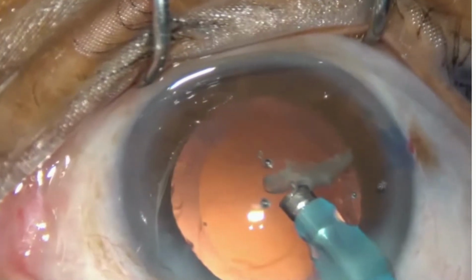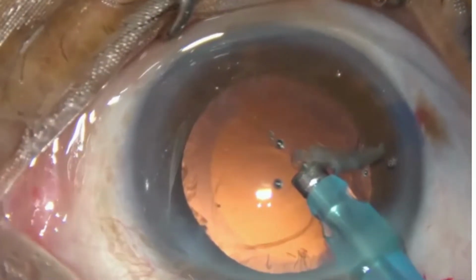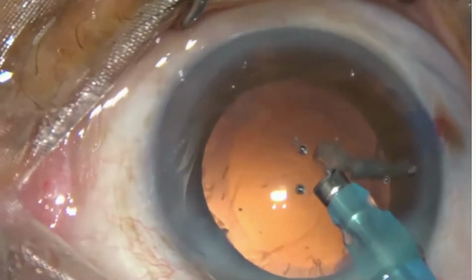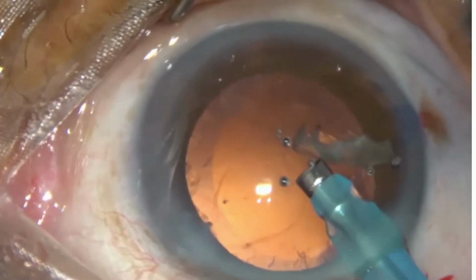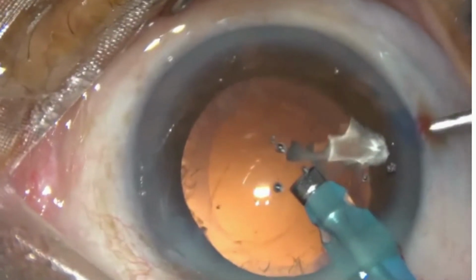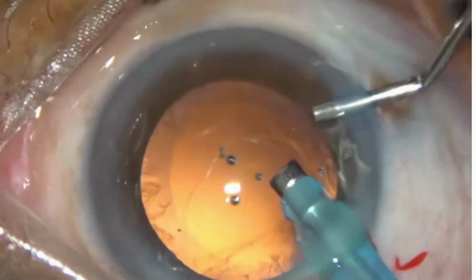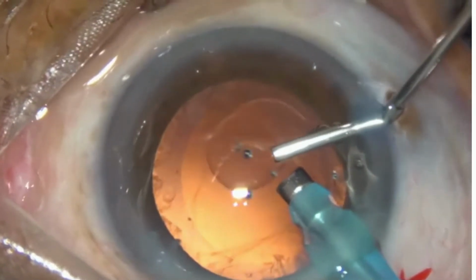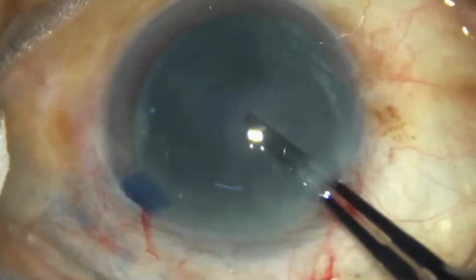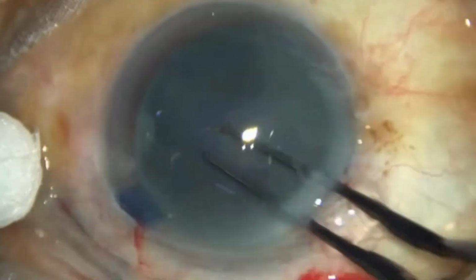Posterior capsular rent. The complication that every ophthalmologist dreads. Anterior capsular radial tears can occur with CCC. If the CCC margin is stretched too much, the rhexis tears can occur during any stage of surgery, but it is most commonly seen when the actual rhexis is done and a radial tear occurs. It is a well-known fact that radial tears increase the risk of a capsular rent. Early recognition and appropriate management of these tears prevents extension to the posterior capsule and subsequent capsular rent.